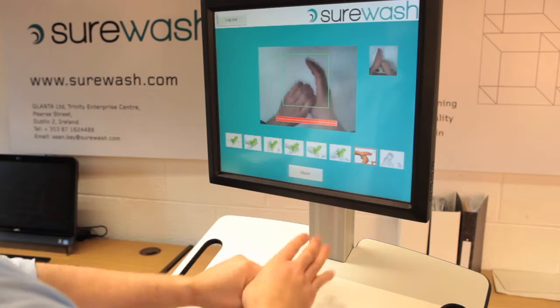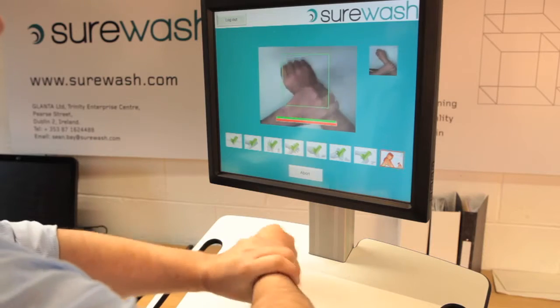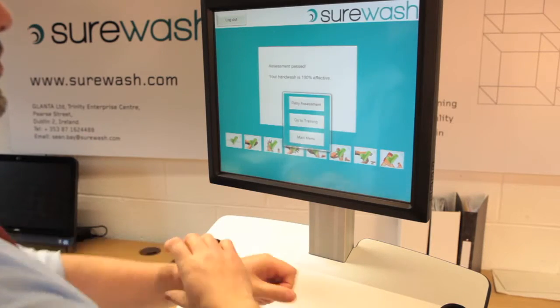It brings us through the 7 poses that we'd use. While we use the 6 from the WHO, we also have the wrist cleaning action, which is a standard practice for the health service in Ireland and also the NHS in the UK. What we'll do is we'll look at the assessment session of this.